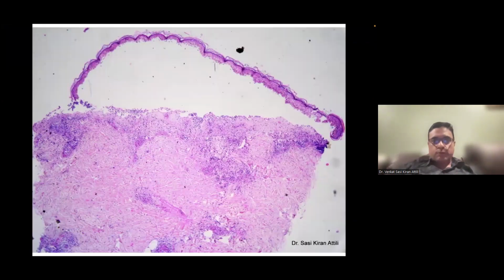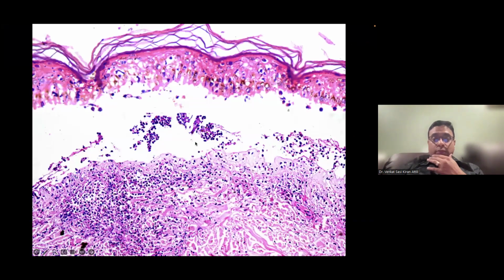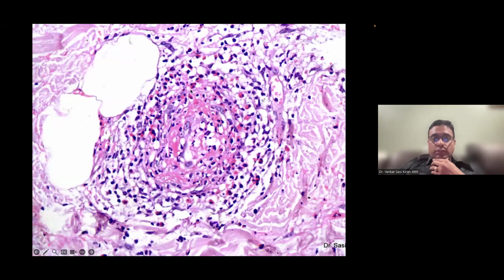Right. So this is an example of leukocytoclastic vasculitis. There's vasculitis there in the superficial and deep dermis, causing a subepidermal bulla. Actually, you can see that this is the epidermis, and there's intraepidermal and subepidermal change as well. You can hardly see the basal membrane, it is destroyed, but you can see the basal membrane here. So it's intraepidermal here, but it can also be subepidermal in a number of cases. And this is a vasculitis because in this case, you can see clear-cut vasculitis with fibrinoid change, intramural neutrophils, eosinophils as well, and nuclear dust here and here.